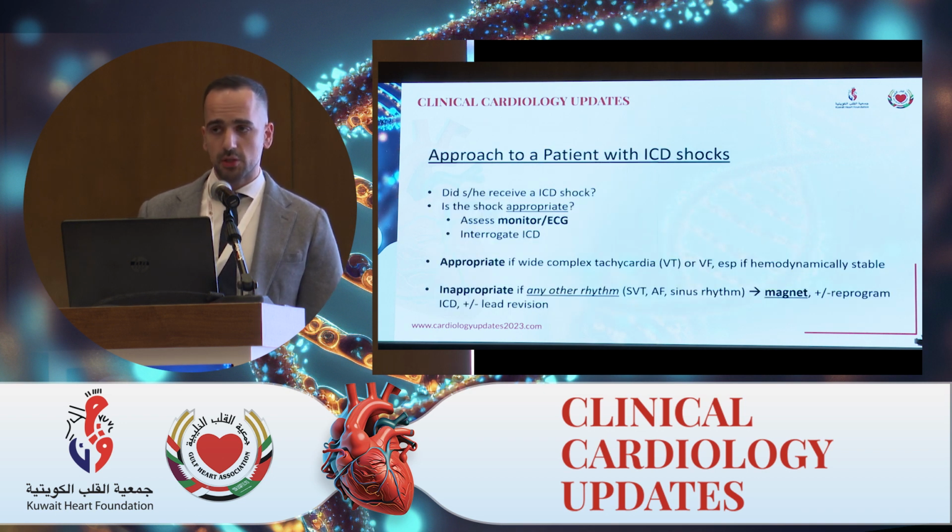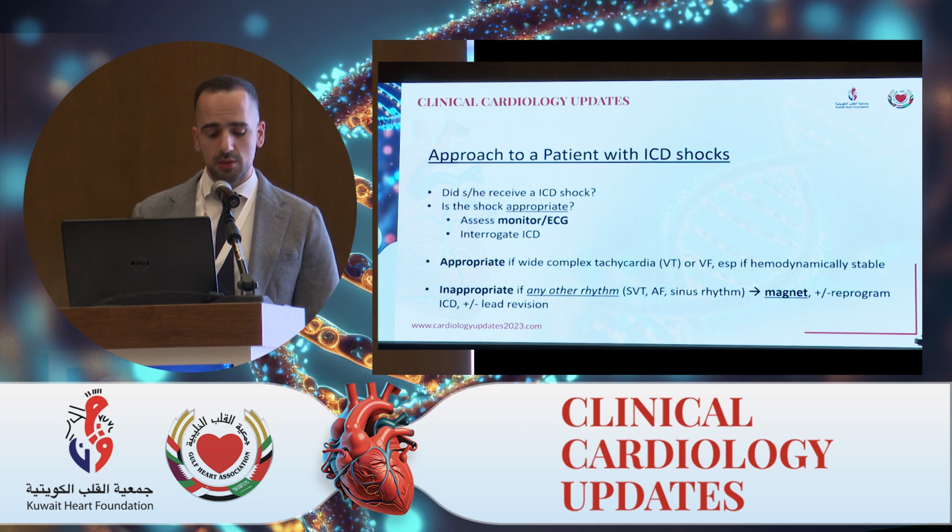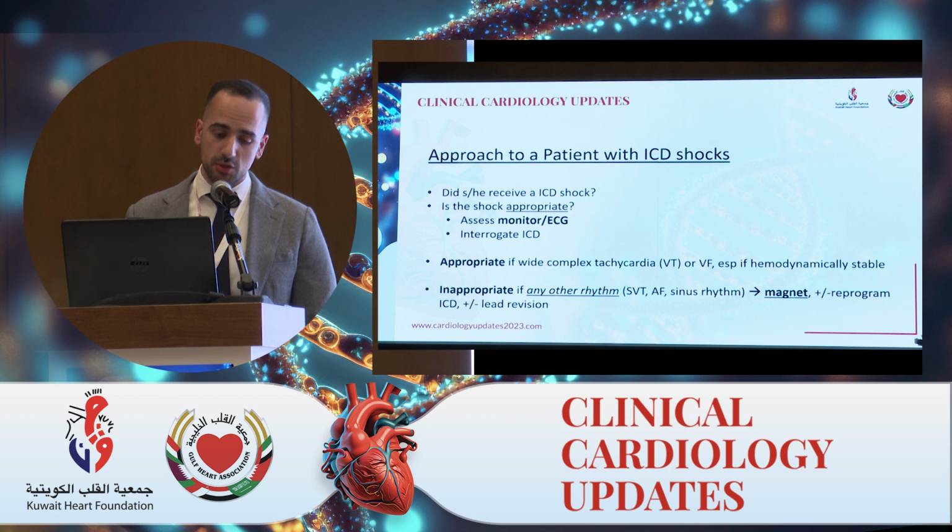When approaching a patient who says he's had ICD shocks, the first question is, did he truly receive an ICD shock? It is important to make sure the patient has a device capable of delivering shocks. And the reason I say this is because during my training, I got called in for a patient who got shocked only to find out he had a loop recorder. So just make sure the device can actually deliver shocks before you open this whole thing.